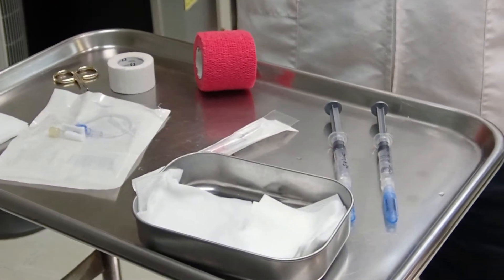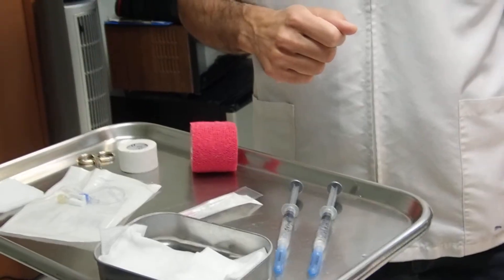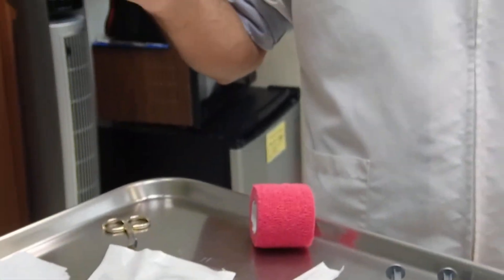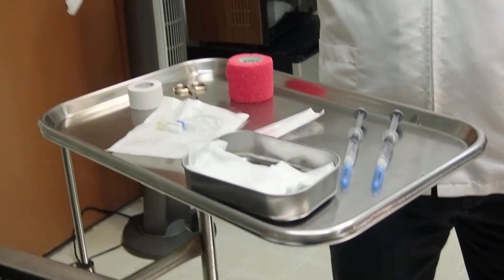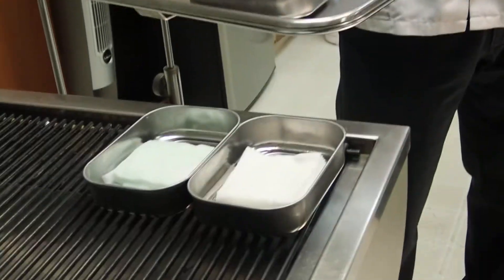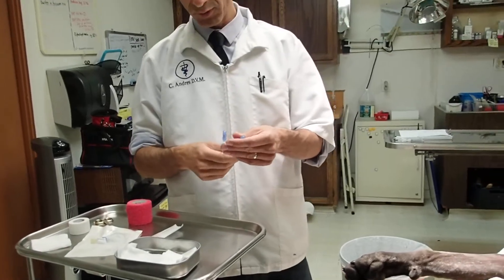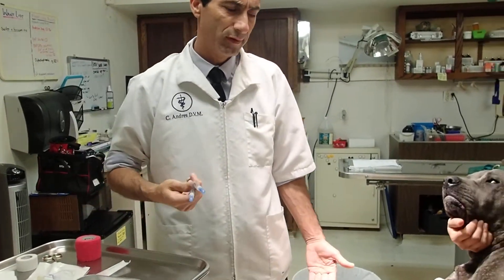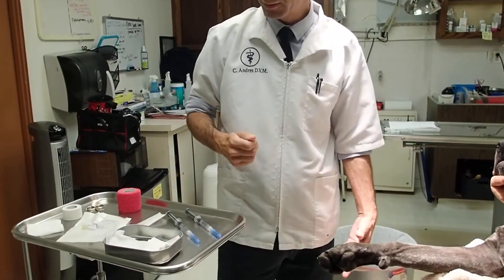What I do mentally is I just walk through the supplies that I'm going to need, and that's how I pull them out. You can have a checklist as well, especially when you're starting off. So we have a 20-gauge intravenous catheter, a T-port, some one-inch white porous tape, some vet wrap, bandage scissors, dry gauze, and gauze with peroxide in case we need to do some cleanup. We have our chlorhexidine scrub, alcohol-soaked gauze sponges, and some saline flush. You could use heparinized saline or just sterile 0.9% sodium chloride, which I prefer. I always prefer not to heparinize my patients before any type of surgery, especially with smaller patients.